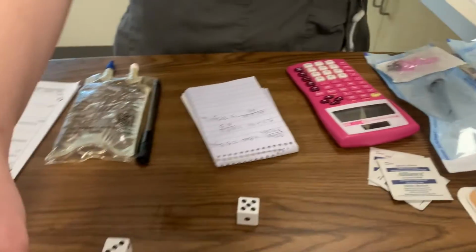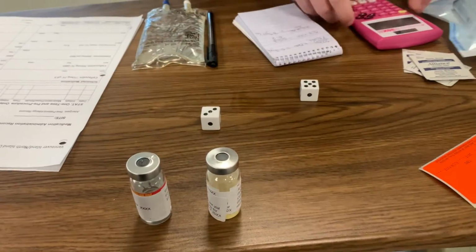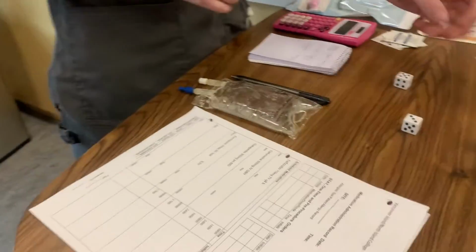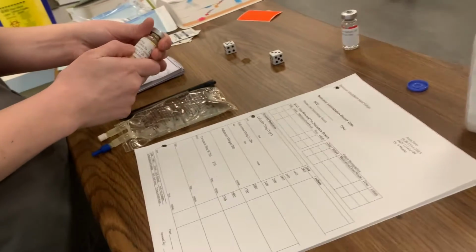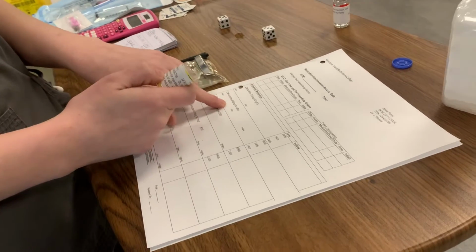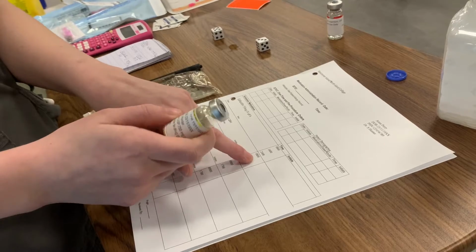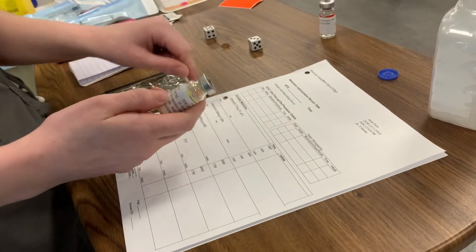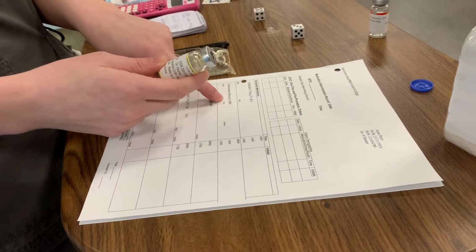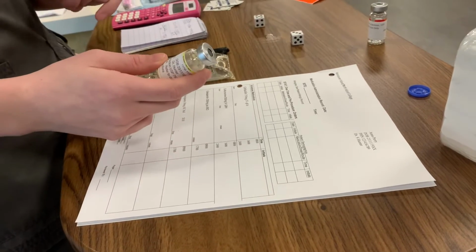Okay, I'm just going to make sure I have my label on there correctly. My calculations are all done, so I'm going to go ahead and do my first check. I have cefuroxime, 500 milligrams for Anna Perry at 0800, wonderful. So I have the right patient, the right time, the right dose, and it's an IV antibiotic, the right route, the right documentation, the right drug. And so my first check is all done there.